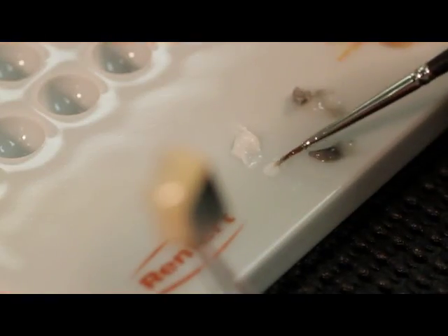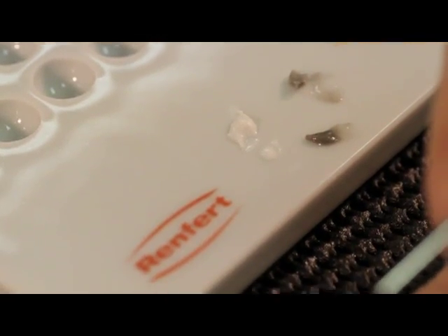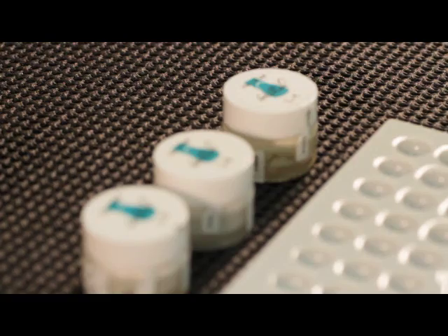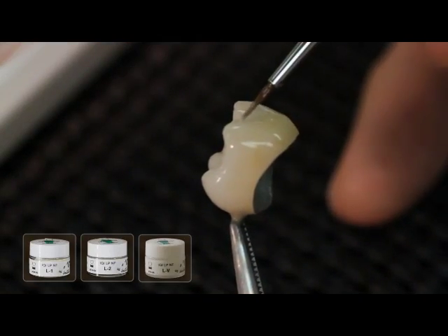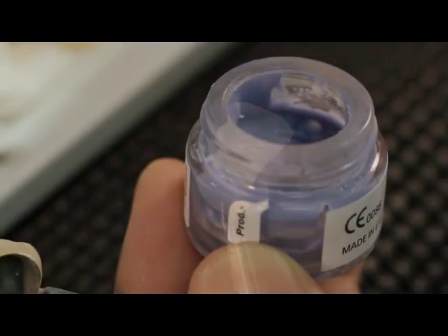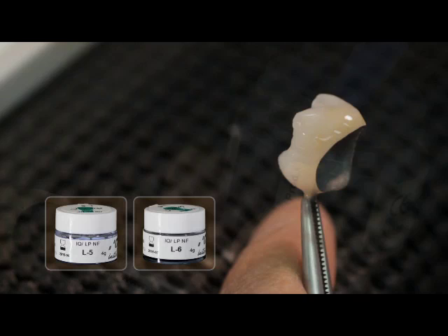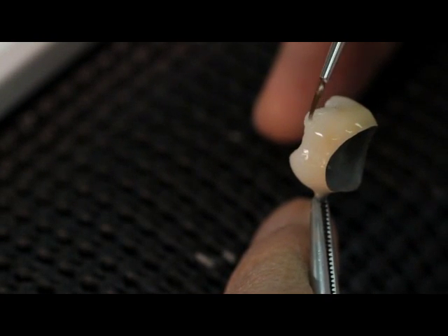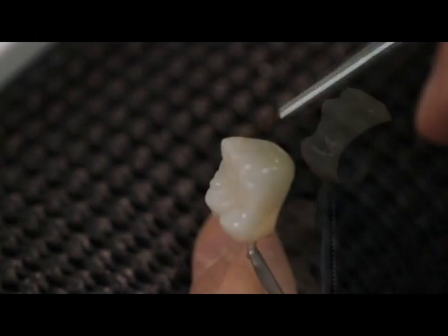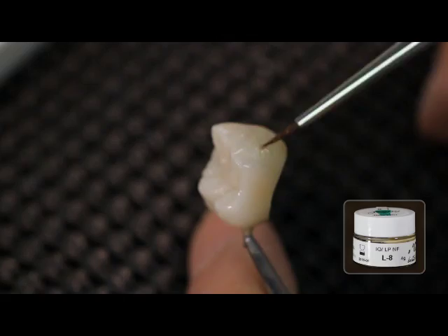For eventual further individualization, you can use the whitish Lustre Paste NF — L1 Vanilla and L2 White — and an LV value for brightening the restorations. Two bluish effect Lustre Paste NF, L5 Light Blue and L6 Dark Blue, provide a bluish opalescent appearance in the incisal area. Greenish effect Lustre Paste NF, L8 Olive, for a greenish effect, can be mixed with all Lustre Paste NF.